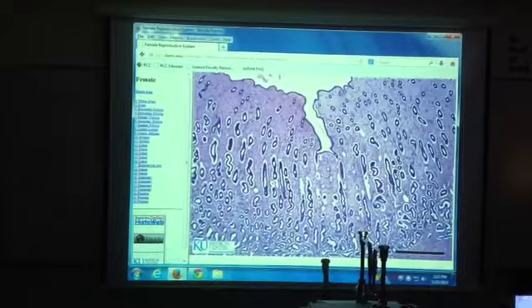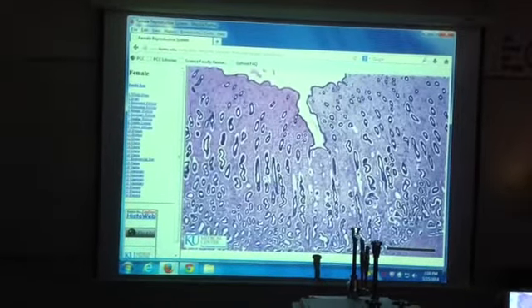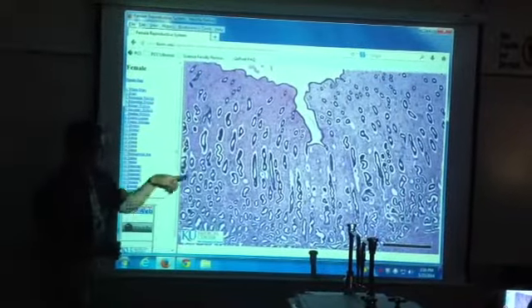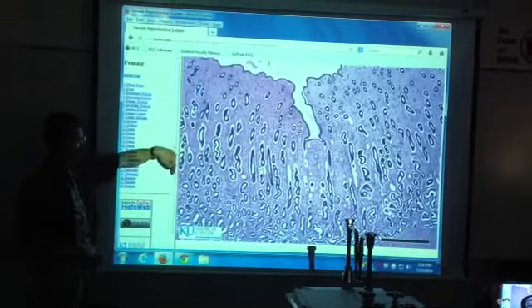Alright. Let's find a uterus. That's where life gets fun. Okay, for the uterus, it's the same slide you saw last week. But now you have to know what stage of your menstrual cycle it is. So what you're going to do with your head and your eyes and your brain is you're going to look at the uterine glands. And you're going to compare them between the different slides.